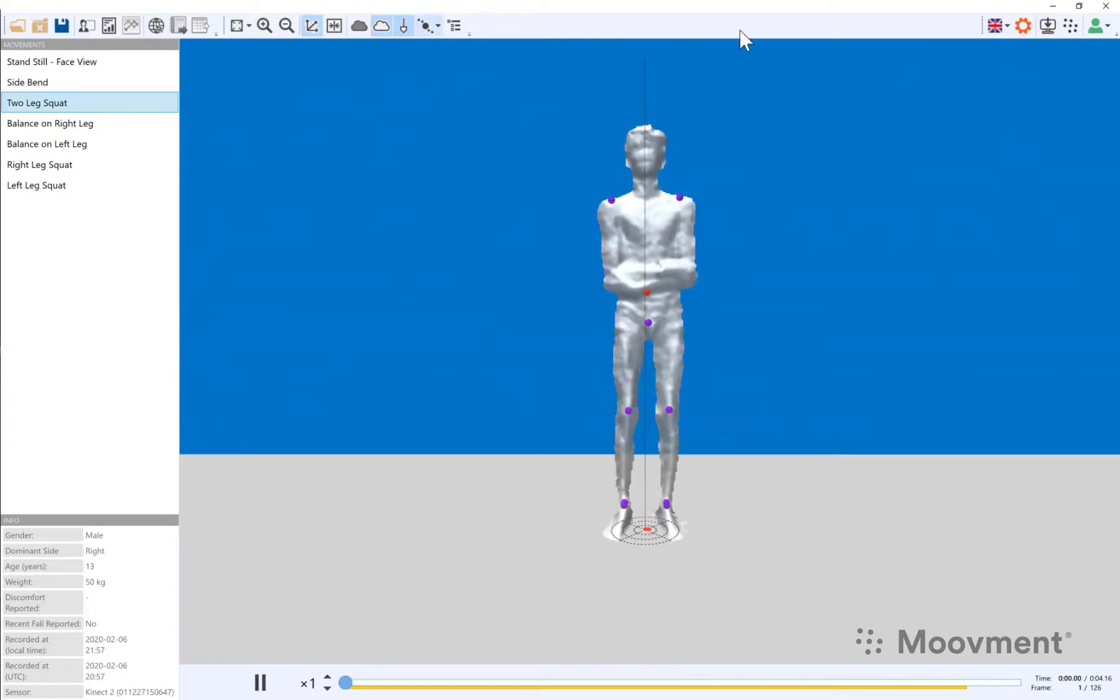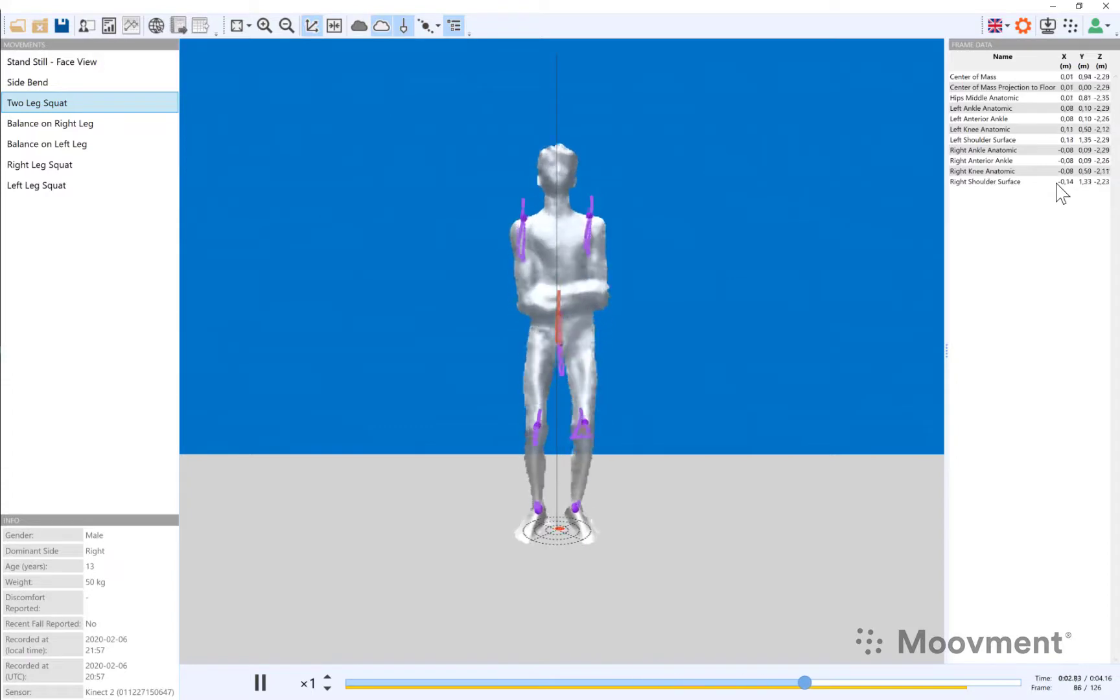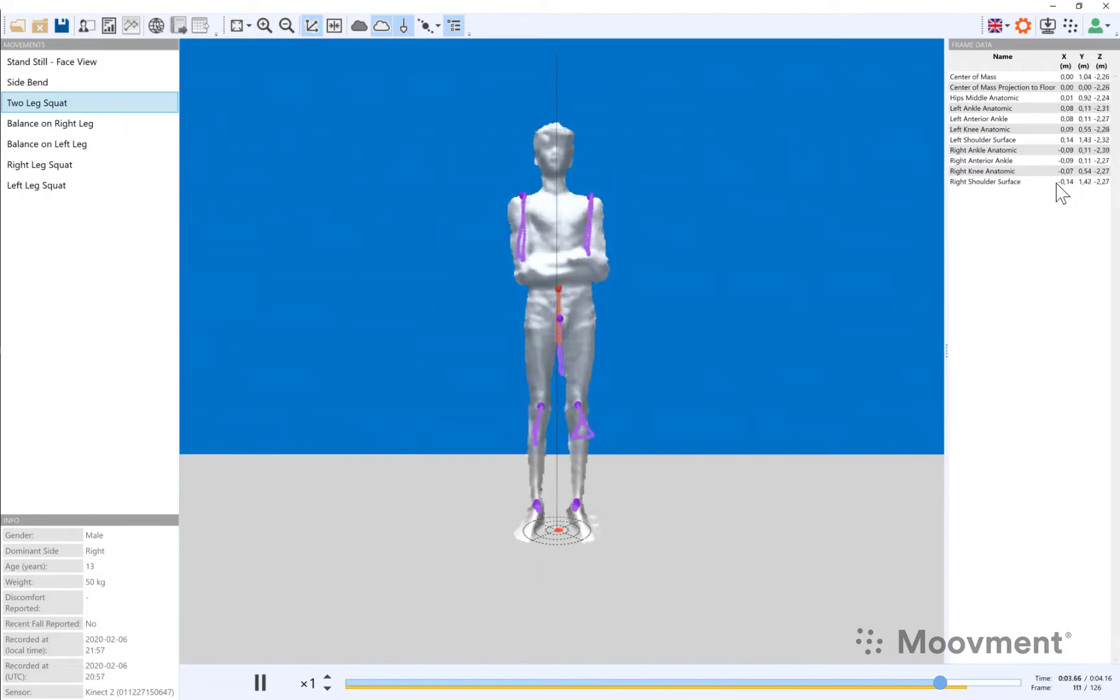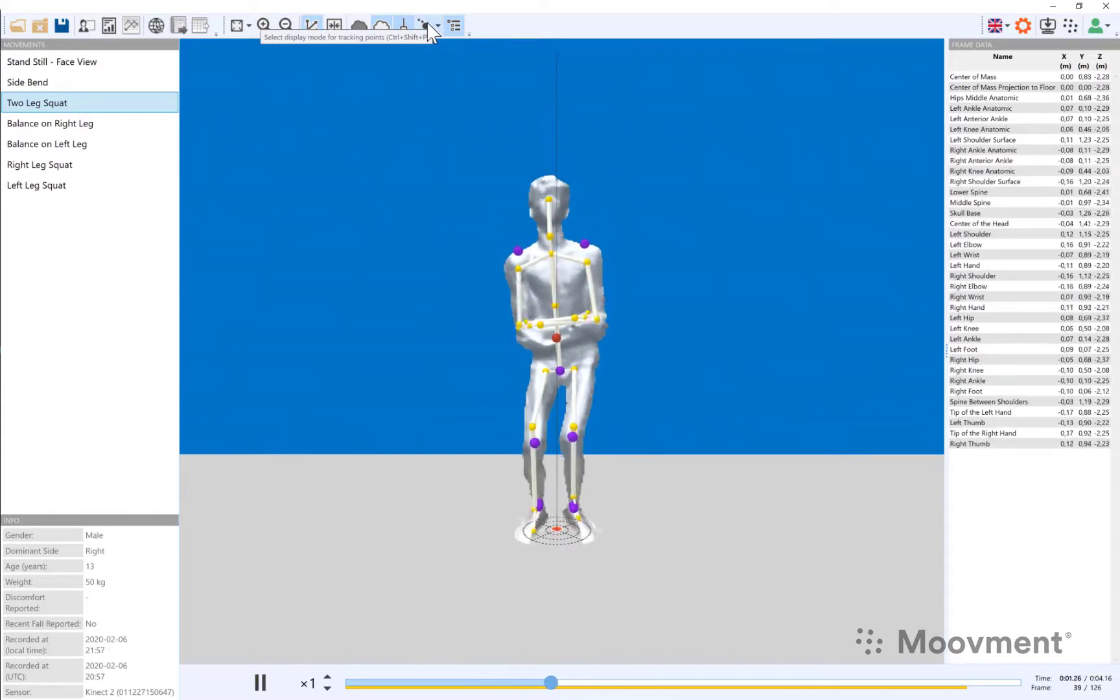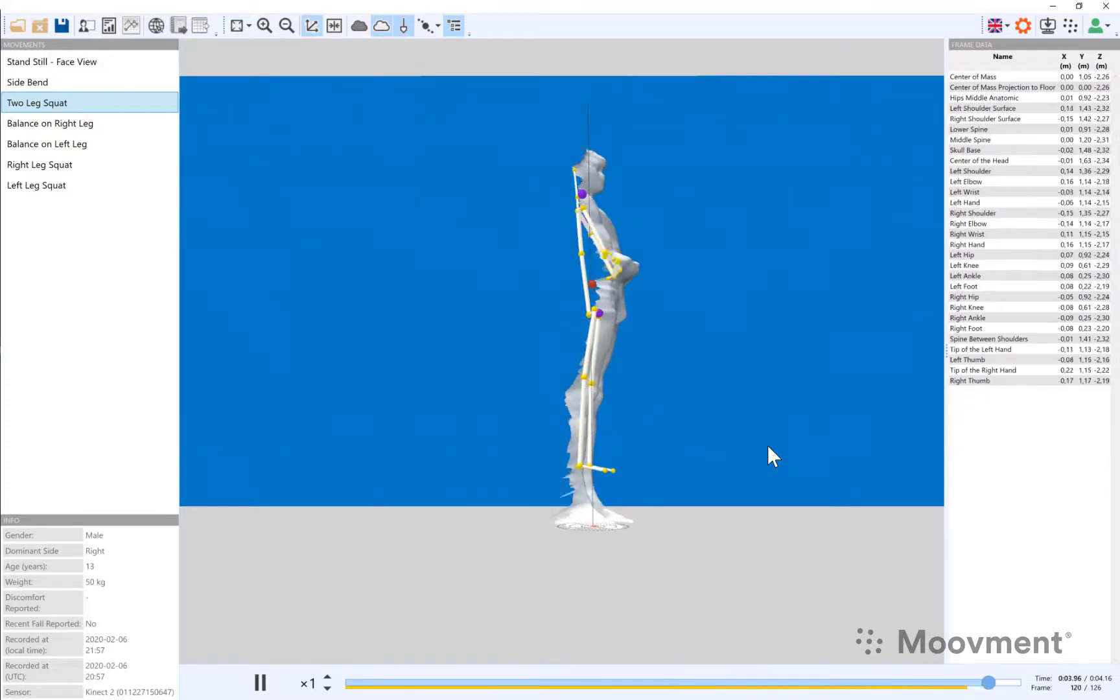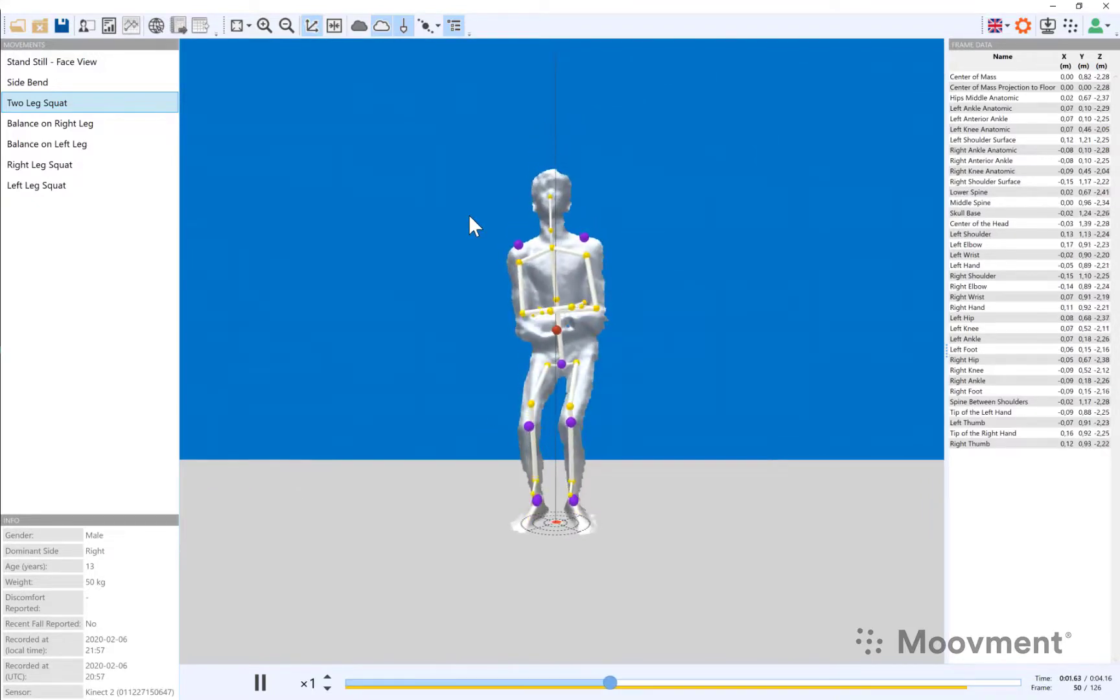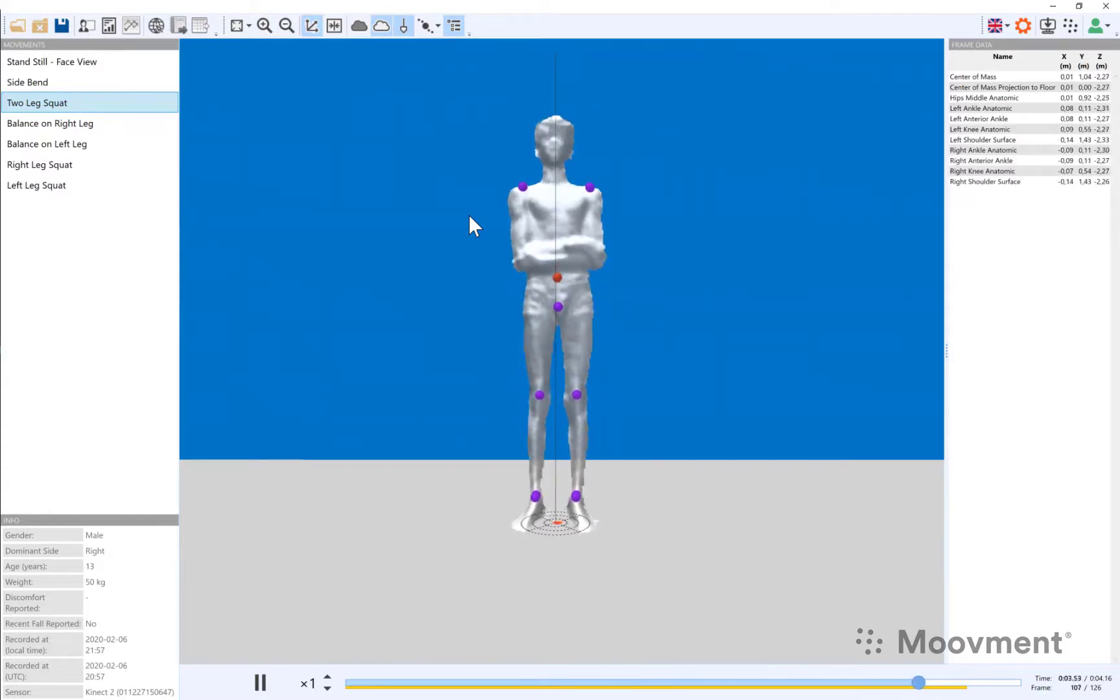The pathways are derived from the XYZ coordinates of all the body parts. We have our own proprietary tracking which is very accurate, and because it's accurate the knees are actually where the knees should be. As a comparison, I'd like to show you some other tracking which comes automatically with various sensors. In this case the knees are not where the knees are and the ankles are certainly not where the ankles should be. So we have our own proprietary tracking algorithms produced by Quinematic for the movement software.